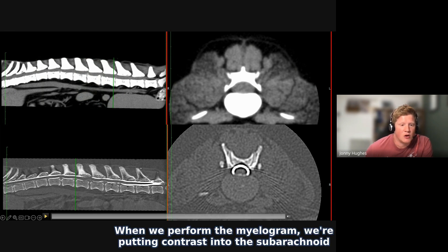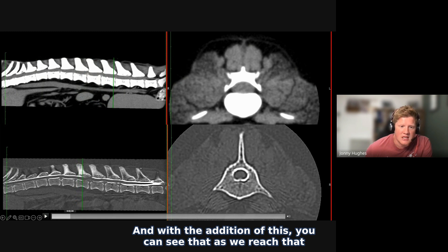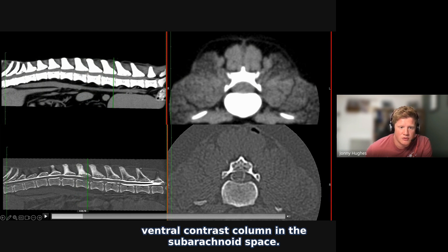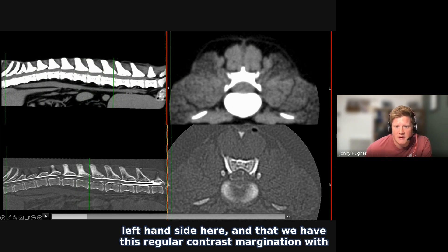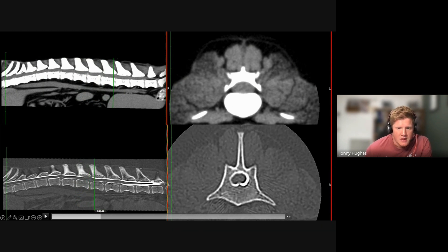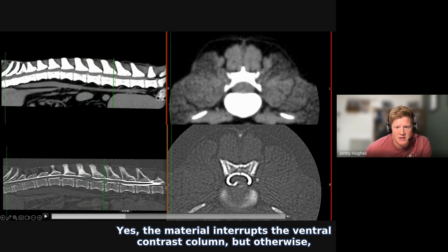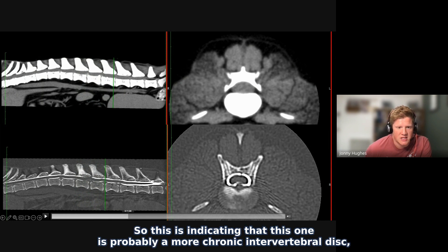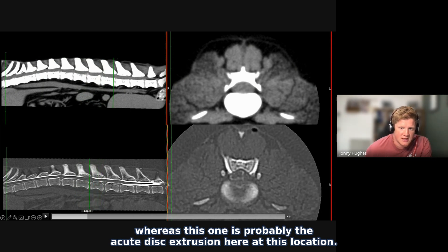When we perform the myelogram, we're putting contrast into the subarachnoid space to delineate the spinal cord better. With this addition, as we reach the first L2-L3 disc, there is both interruption of the dorsal and ventral contrast column in the subarachnoid space, the spinal cord is pushed over to the left, and there is irregular contrast margination with material within the vertebral canal on the right. At the other disc herniation, the material interrupts the ventral contrast column but the contrast column is otherwise circumferentially intact around the spinal cord. This indicates that one is probably a more chronic intervertebral disc whereas the L2-L3 location is probably the acute disc extrusion.